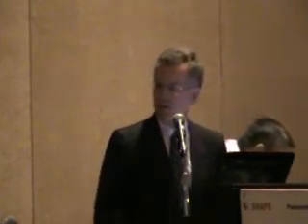another question that comes up is, should I use automated edge detection to measure this, or should I do it by hand? Which is better? Which is more predictive? People literally almost attack each other at podiums on this particular topic. There's the automated edge detection crowd. Usually the fellow arguing the strongest has actually developed his own algorithm, and so he's vociferous that that's the way to go. The hand group is another crowd.